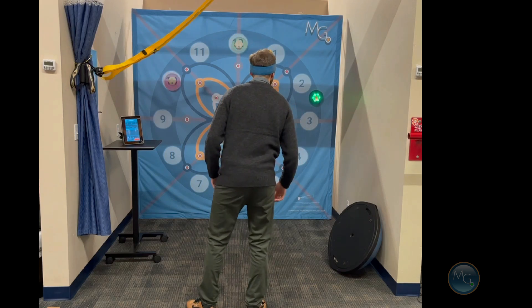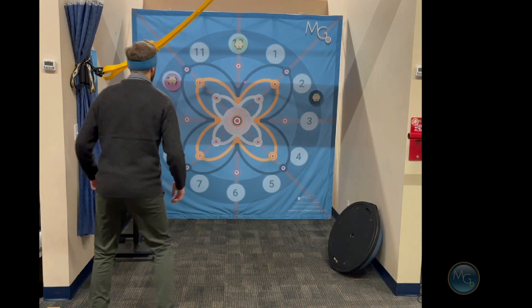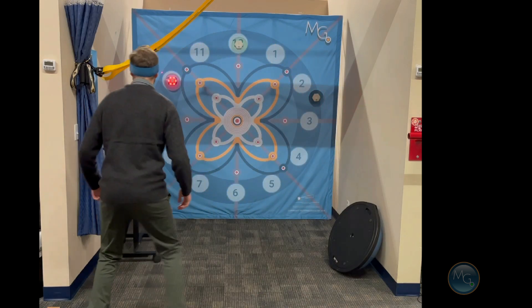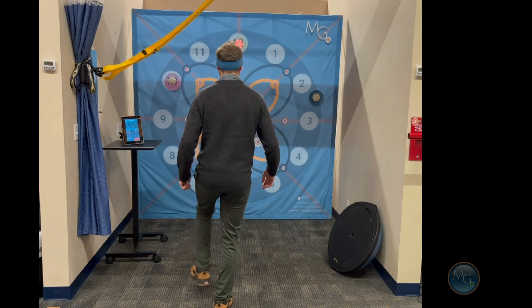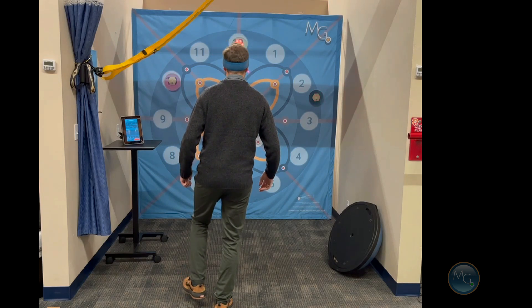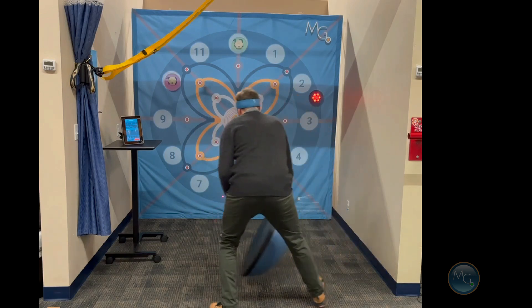Now you could obviously add some things like walking around, trying to add a challenge by doing different movements, catching a ball, standing on one foot. You can stand on a bosu ball.